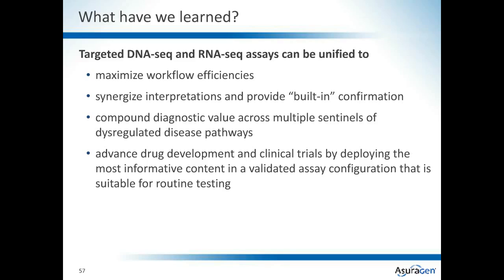That you can get diagnostic value by looking at pathways at a much broader level than just individual mutations, and that ultimately this approach can advance drug development and clinical trials by taking the most informative content from DNA, from RNA, etc., and putting it into a validated assay configuration that can be amenable in a workflow for routine testing.